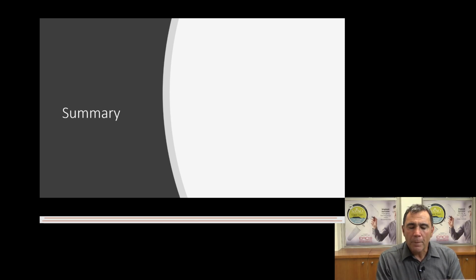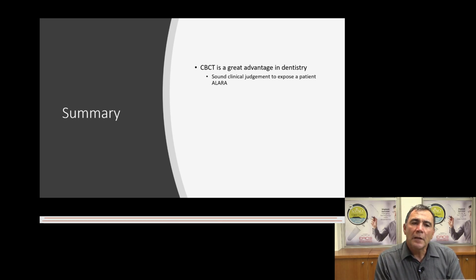So, in summary, I would like to say CBCT is a great advantage in dentistry. The sound clinical judgment to expose a patient is critical, using the ALARA principle, but do not be stupid about it. If you give too little radiation, the computer can only give you back what you give it. And if it gets a poor image, it's going to take the points that it recognizes and link the two.